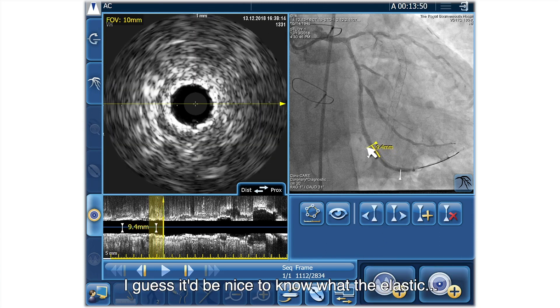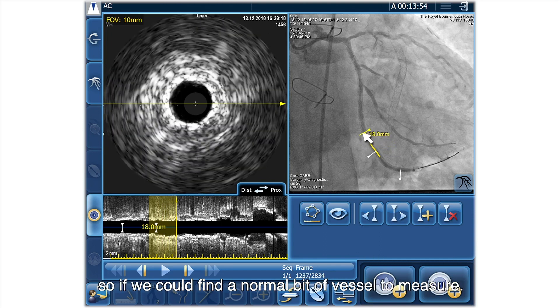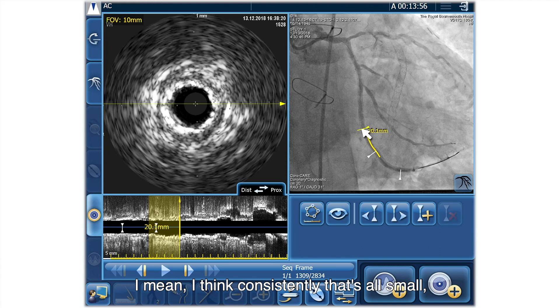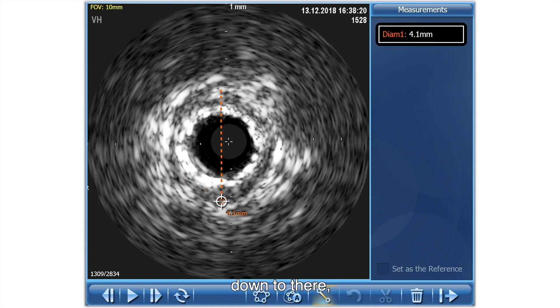It would be nice to know the elastic reference - there are no major branches, so if we could find a normal bit of vessel to measure. I think consistently that's all small, so let's measure that there. We can see the media, so I'll just do a diameter - about 4.1. So I guess we need to make these stents a bit bigger. Certainly in the mid-segment, approximately - I think it's still 2.5.